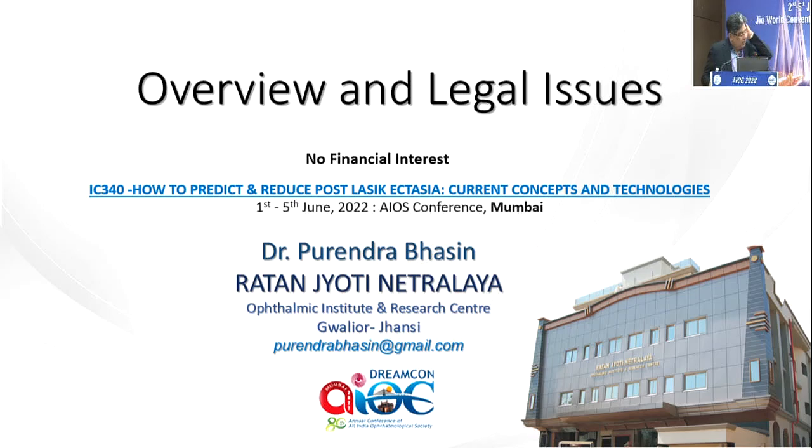I just wanted to have a word regarding topography. This is a recent or current ABCD scoring system which comes in the new Pentacam by Belin and Ambrósio, and this is a superior index. It takes into consideration, apart from anterior and posterior corneal curvature, the corneal curvature in a 3 millimeter radius around the thinnest pachy, and that is the good part.